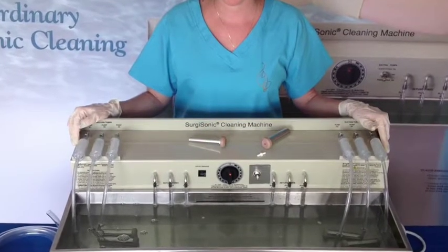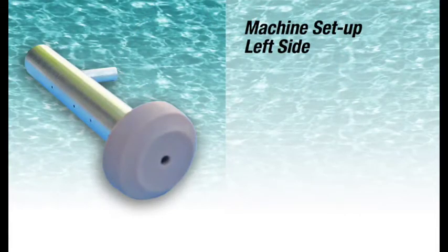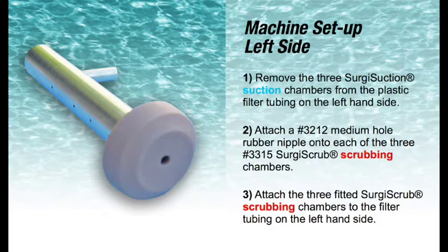Surgisonic 1211X machine setup for cleaning DaVinci robotic tubular instruments. Machine Setup Left Side: 1. Remove the three Surgi Suction Chambers from the plastic filter tubing on the left-hand side. 2. Attach a No. 3212 medium hole rubber nipple onto each of the No. 3315 Surgi Scrub scrubbing chambers. 3. Attach the three fitted Surgi Scrub scrubbing chambers to the filter tubing on the left-hand side.